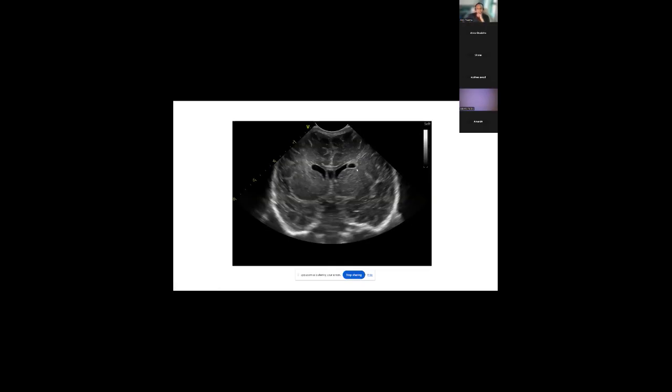Yeah. I was looking at going through all the lectures again, and the one that Dr. Eamon had done, he had spoke about connatal cysts, and on the sagittal view, which we'll obviously get to, I think it kind of looks like that. Yep, perfect. Okay.